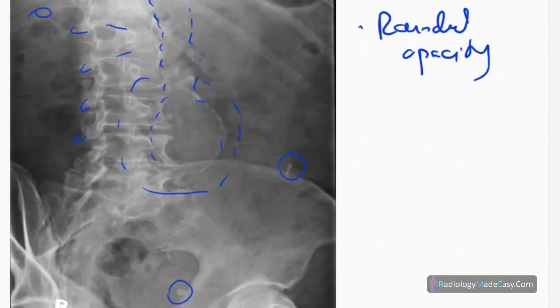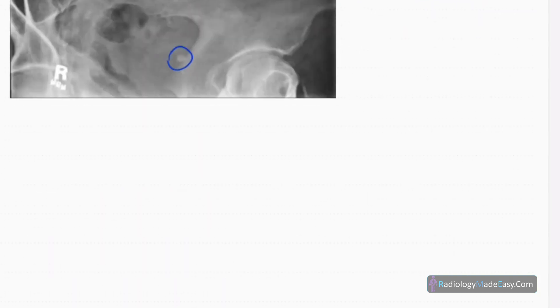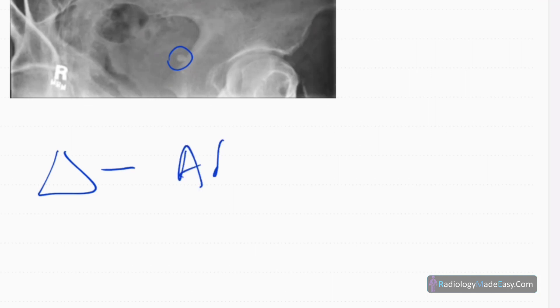So the problem is that rounded opacity in the region of the abdominal aorta. The diagnosis in this case is abdominal aortic aneurysm.